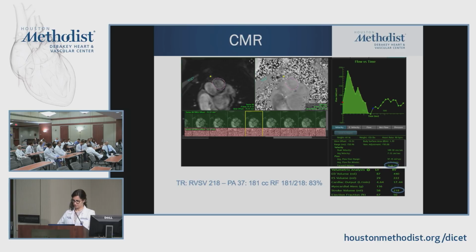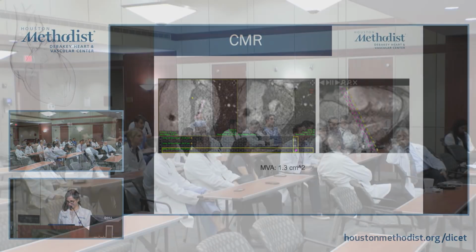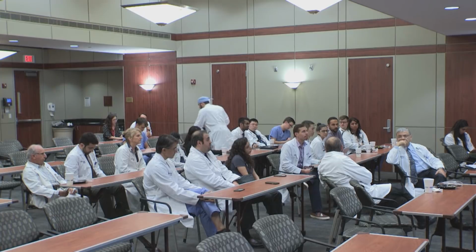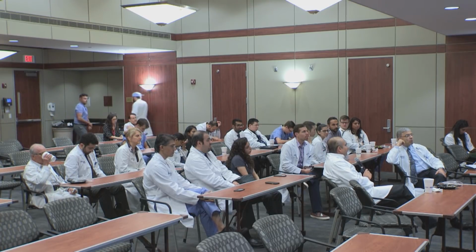For echo, every 10 cc difference in the absence of any valvular lesions is acceptable within the error of the measure. For CMR, how many cc's is acceptable in the absence of any real lesion? Well, how do you define the absence of any real regurgitation? In a normal subject, I can measure flow in the LVOT and come up with, say, 65 cc's, and I can measure mitral inflow volume and come up with 55 cc's. That's acceptable because of the errors we usually encounter. The maximum error should be about 10 cc's. If you get more than a 10 cc difference between your aortic flow and your PA flow, then you worry there's a discrepancy. But up to 10 cc's could be normal variability. So about 8 to 10%. It depends on the flow state, but probably 5 to 10%.